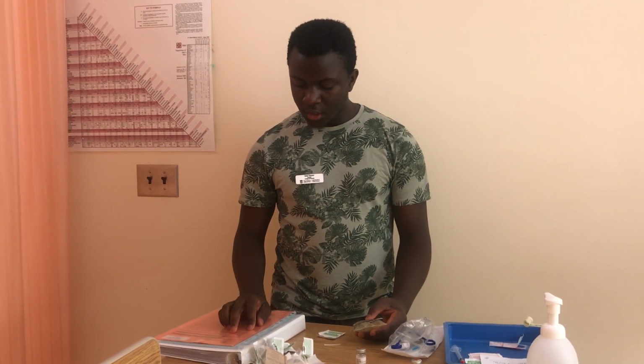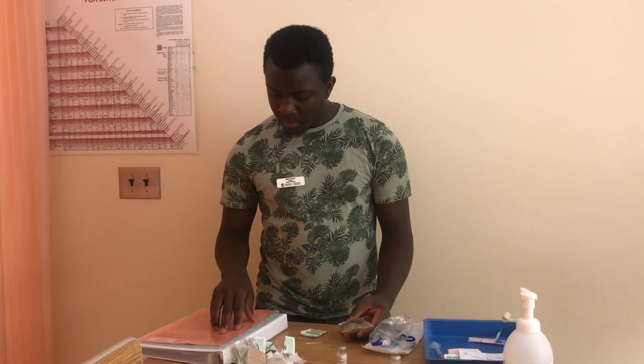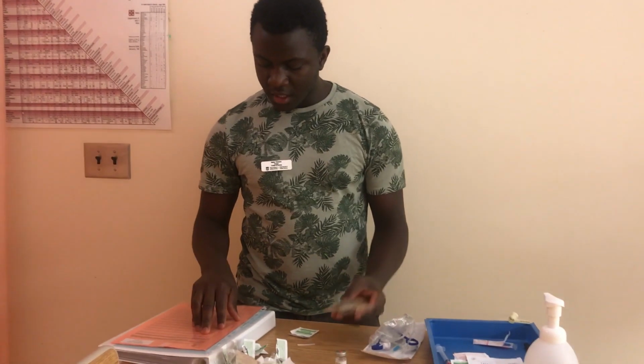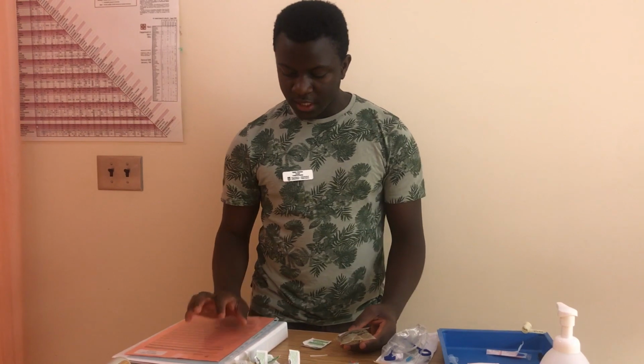So methylprednisolone, and the dose is 75 milligrams. The route is IV. Frequency every 6 hours, and the right time will be now, which is 1400. So that is good to administer.